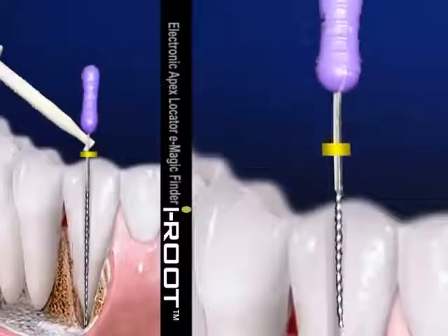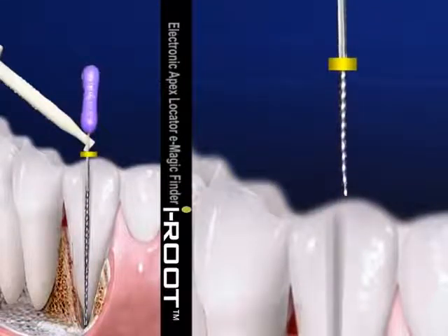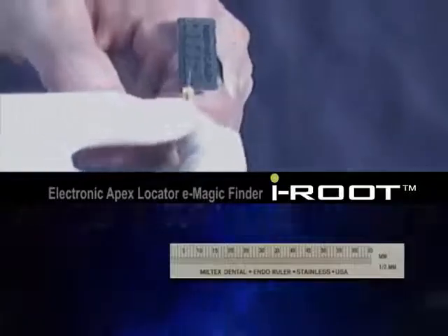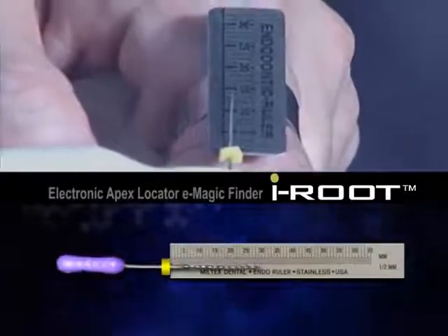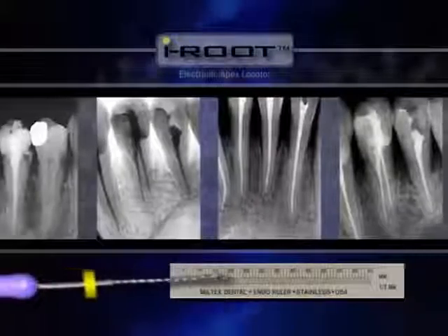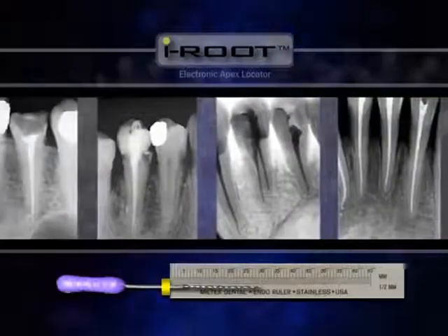Move the rubber marker as close as possible to the root canal's entrance and slowly take out the file. Use a dental scale as needed to measure the length from the rubber marker to the file's tip. This is called working length. It is highly recommended that you take an X-ray to check the measurement.